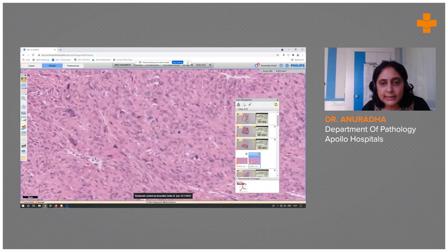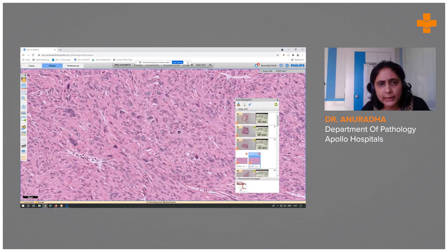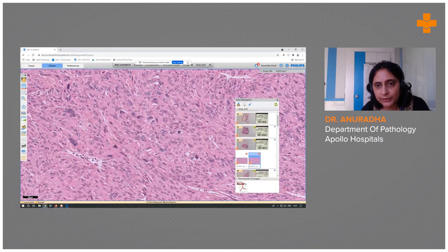These spindle cells had spindle to oval nuclei with somewhat conspicuous nucleoli. A few multinucleated giant cells were also seen, and these are the mitotic figures.